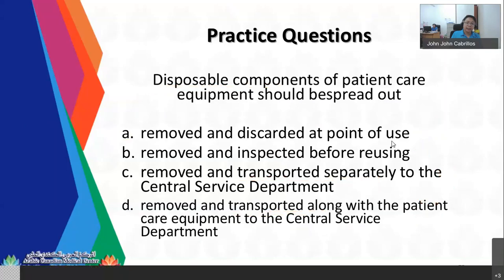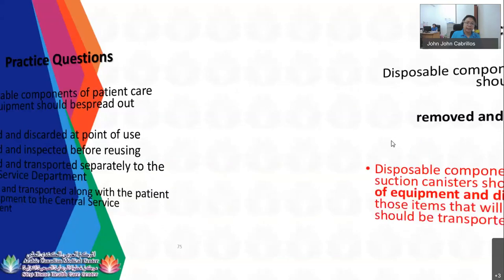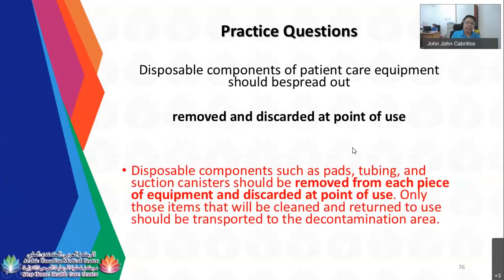So next, removed and discarded at the point of use: disposable components such as pads, tubing, suction canisters, or any disposable sharps should be removed from each piece of equipment and discarded at the point of use. Only those items that will be cleaned and returned to use should be transported to the decontamination area. Okay.